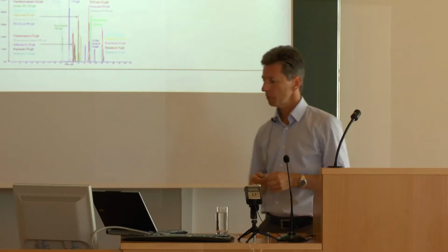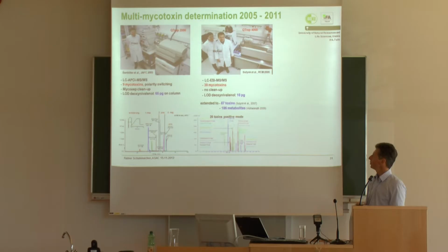So a couple of years later, Michael Suljok was already in the team. So you see, now they are twins. Again, an LCMS method was in place with 39 mycotoxins, and for the first time without any cleanup.